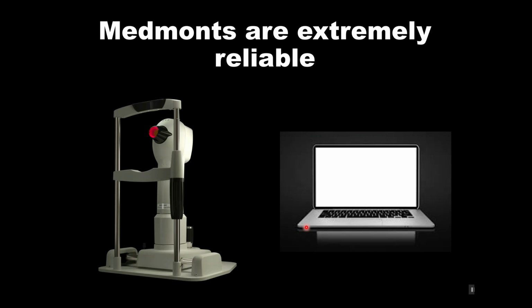So if you have a problem with the mouse, a problem with the keyboard, a problem with the screen, you just go to your local supplier and purchase a new computer or get it repaired. The Medmont isn't likely to need a lot of work to it just because it doesn't have many moving parts.